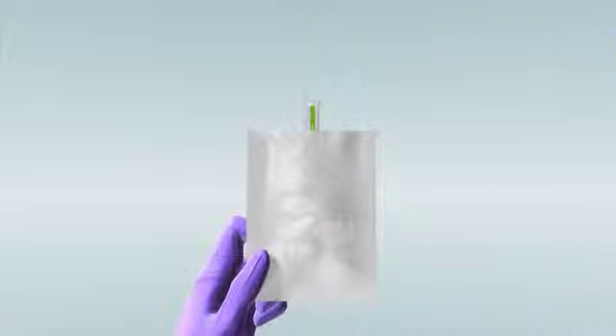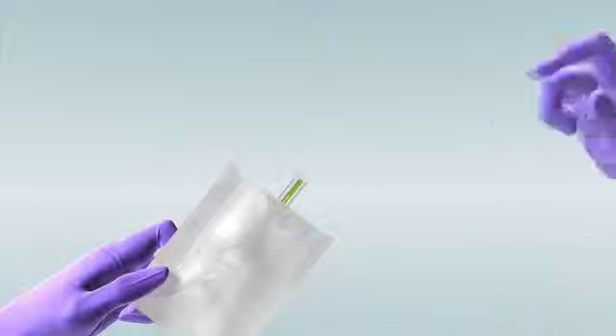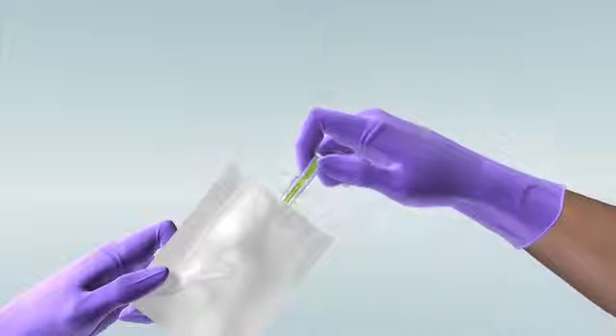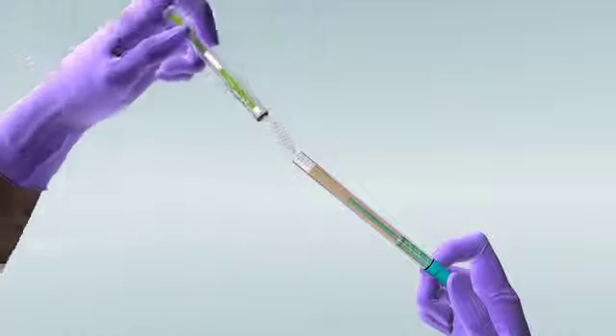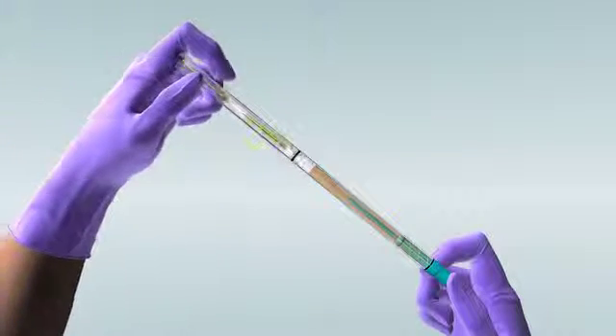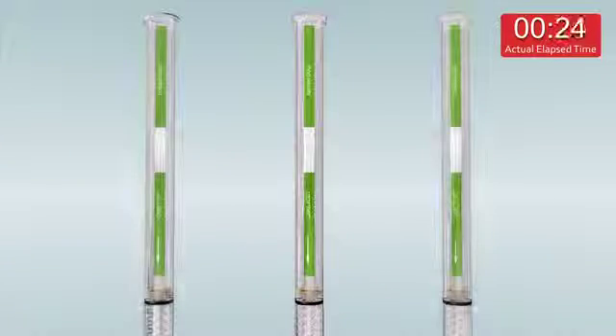Remove the test strip from the accompanying foil pouch. Carefully connect the test strip to the sampling tube, being sure to hold the tubes vertically with the test strip on top. The solution will wick up the test strip and tint it pink. Use the perforated hole in the side of the Self-Sure box to hold the test upright while you wait.